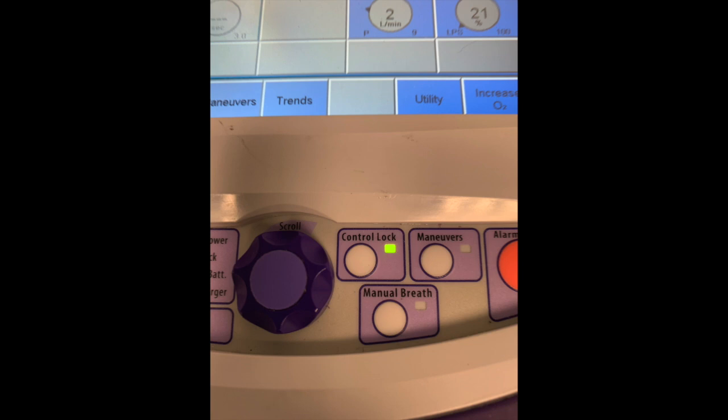I do want to caution you, you should also enable the control lock after you've completed the settings and before placing this on the patient. The last thing we want to do is to accidentally select a volume control mode and cause significant barotrauma to the patient.